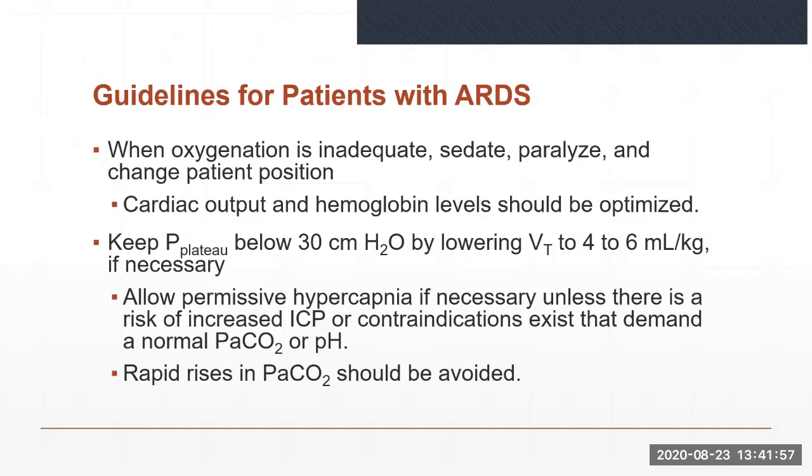Use a flow greater than 60 liters per minute for volume controlled ventilation. During pressure control, use an I time that is long enough to enhance oxygenation, but short enough to allow adequate expiratory time to avoid auto-PEEP. Because time constants are short for many lung units, especially with decreased compliance, this is usually not difficult, even for I:E ratios of 1 to 1.5 or higher.